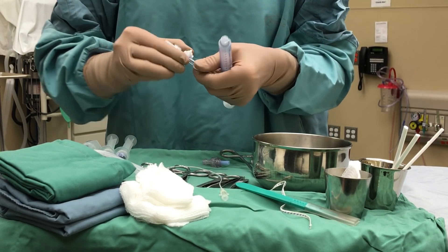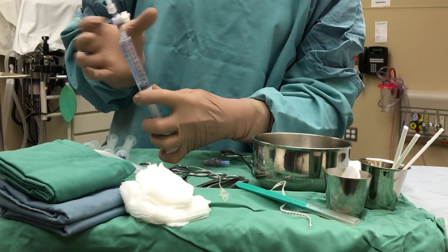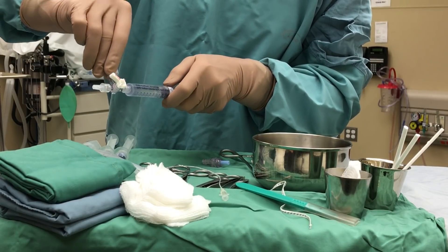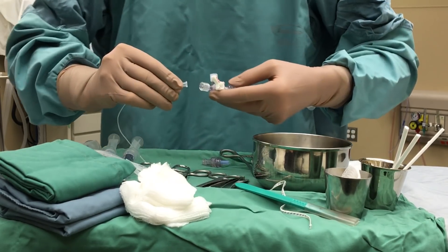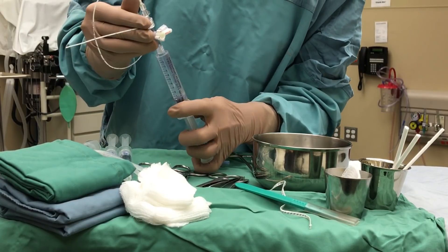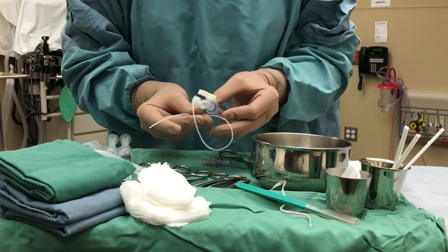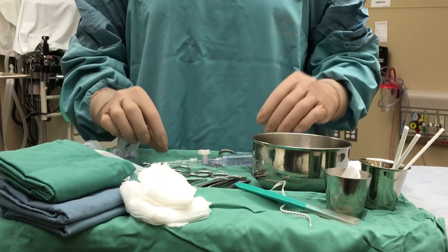First, ensure all the air is out of your syringe — this is sterile normal saline. Take your three-way stopcock and insert it to the end, always holding it vertical to the ports to ensure that the air rises. Always flush out every port, gently tapping to ensure all the air rises. Once that's done, recap. Attach the catheter to the end and again flush through, ensuring all air is out by tapping in a vertical position. When everything is flushed, turn it off to everything — that ensures you are ready for insertion and no air will re-enter the system.